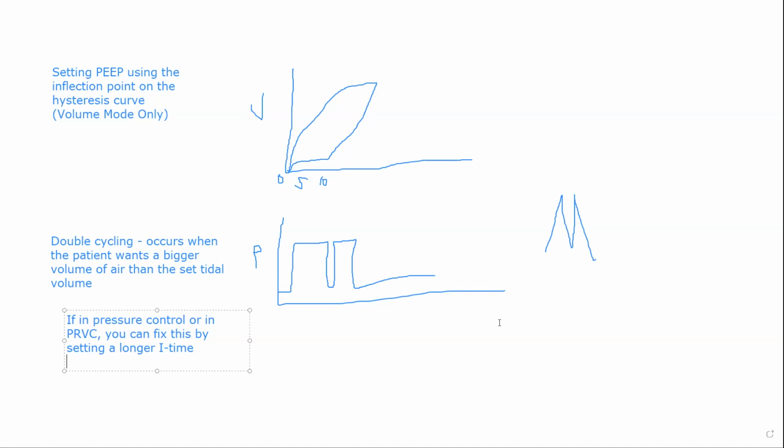If PRVC wasn't working, switch over to pressure control and now it's working. Very good. So you understand that. Oh my God, I'm so proud of you guys.